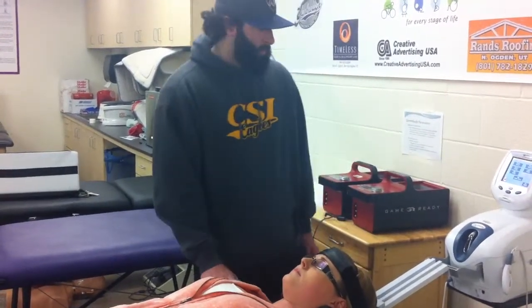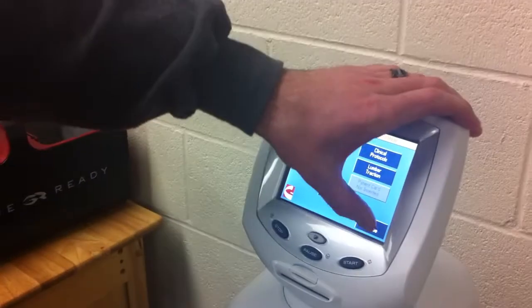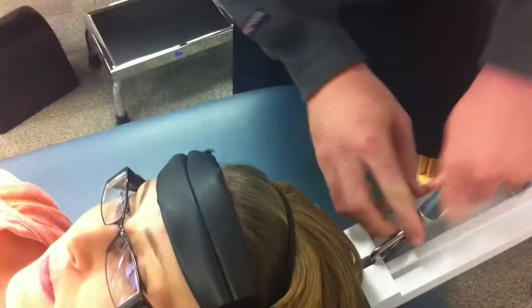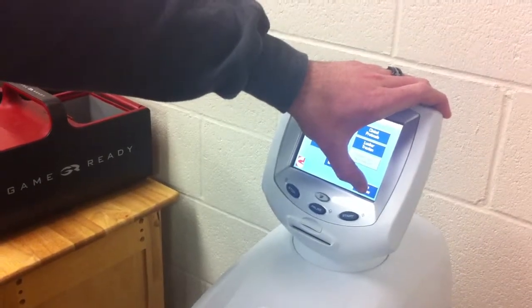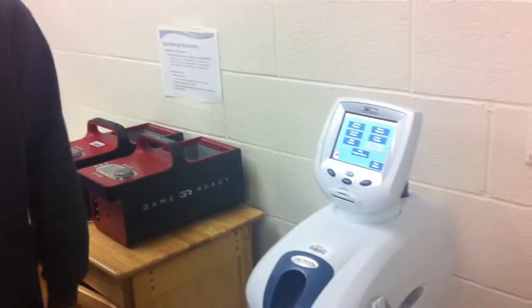to pull. Once we've got them here, if you come over to your device, there's a rope release button. If you hold that and pull out, that's going to give you slack to be able to hook up your rope, and then same thing to take the slack out, just push the button and it'll take the slack out. Once we've got them here, we can also take the table up or down to increase flexion or extension of the neck depending on what pathology we're trying to create traction for.